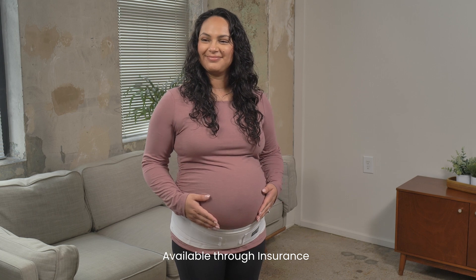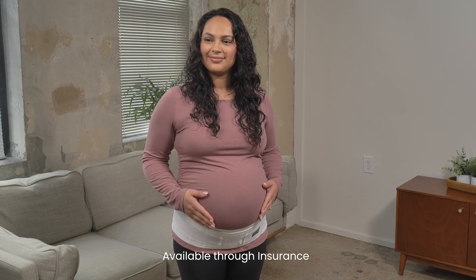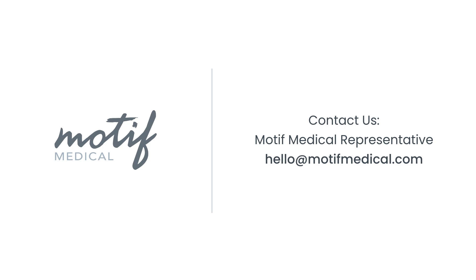And that's it. Your pregnancy back brace is now ready for use. Enjoy the comfort and support it provides during your pregnancy.